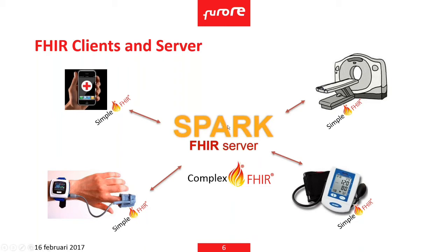Why do we need a FHIR server? Well, the FHIR standard had the intention to make it very, very simple to create a client. You can just do a few REST calls, get the resources back, for example in JSON, and then show them. Or if you have an imaging device and you want to send the metadata to someone else, you create a resource that contains that and send it over an HTTP interface.